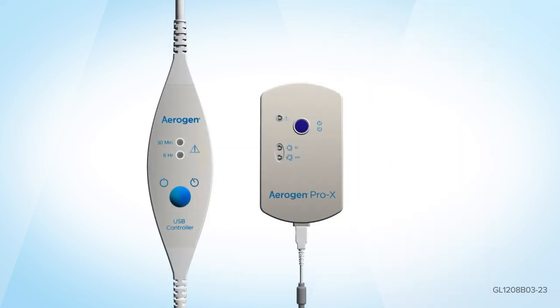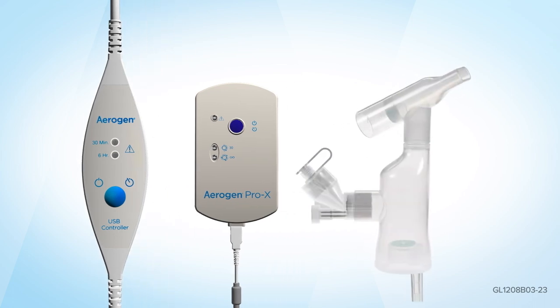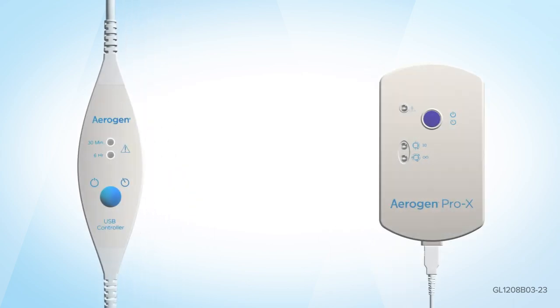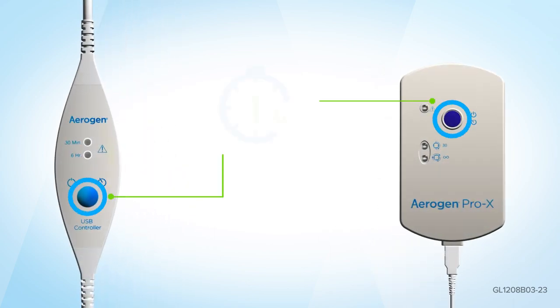Connect either the Aerogen Pro-X controller or Aerogen USB controller cable to the Aerogen Solo. Press the on/off button on either controller for 1 second to select the 30-minute mode.